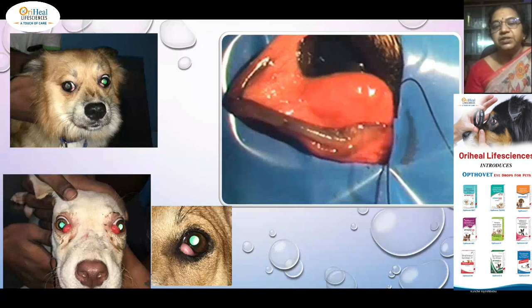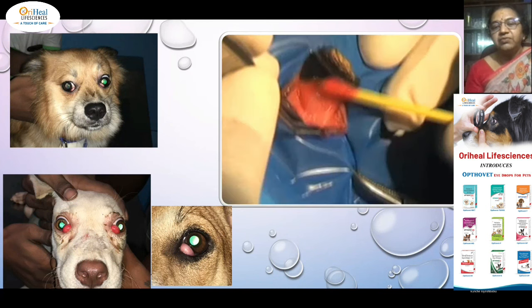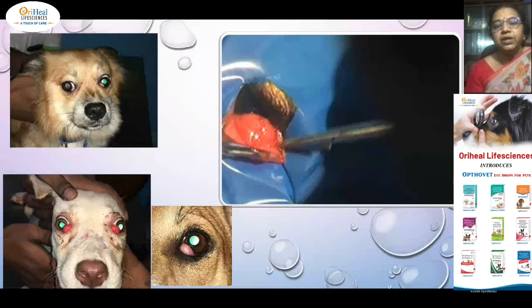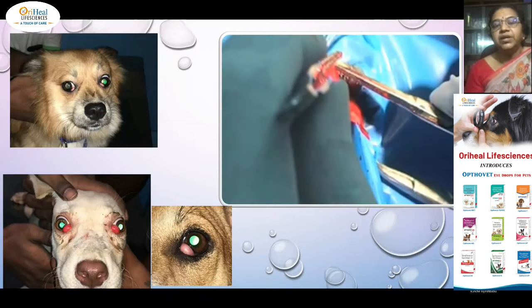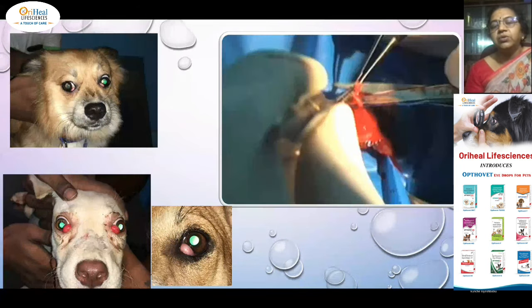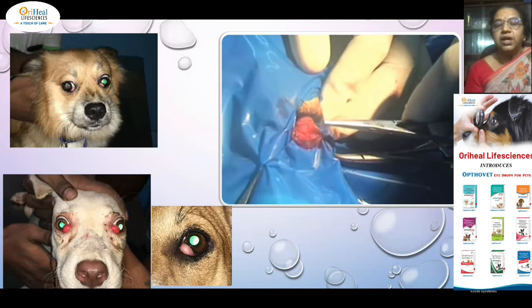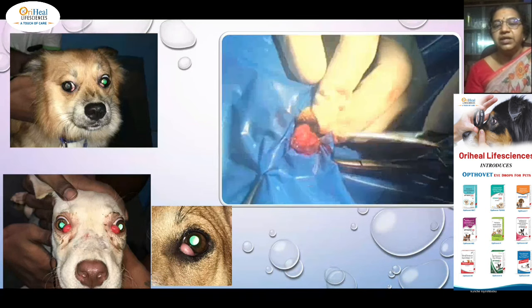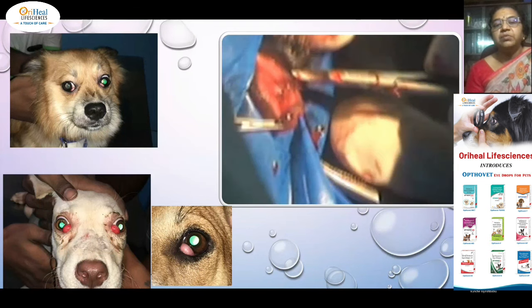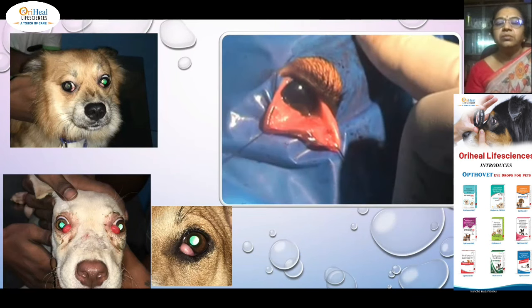This is actually an amateur picture which we have done a long time back, just to show you the different types of drapes which we were using initially. These are not adhesive drapes. So two parallel incisions can be applied on either side, and that small piece of the tissue can be removed from the conjunctiva and from the gland surface, and then you can make a pocket on either side and then start closing. Sometimes you will not be able to depress it. So start closing, at the same time try to depress the gland, then it will stay in position.